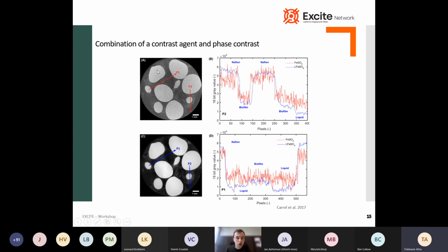This is again a flow cell where there are sand grains or another kind of grains in which biofilms grew. As a contrast agent here, iron sulfate was used, which the bacteria of the biofilm constantly oxidized, which led to precipitation and incorporating the iron during growth. The iron is not ideal because it's not that heavy, so it's still hard to see a lot of biofilm on the upper image.